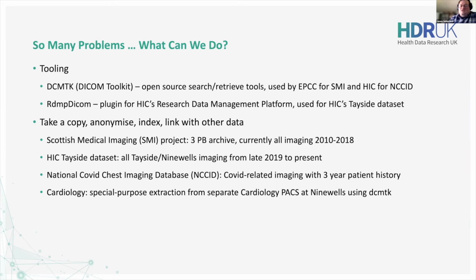And DICOM is expanding in modalities. We've focused largely on X-rays, MRIs, CTs, but it does cover a wide variety of other modalities, like PET scans, and is constantly expanding into things like dental X-rays.